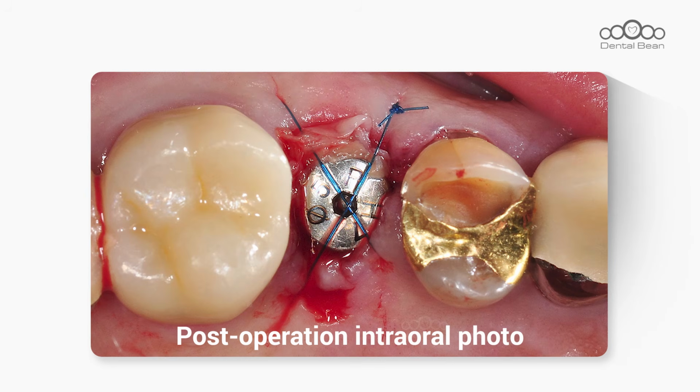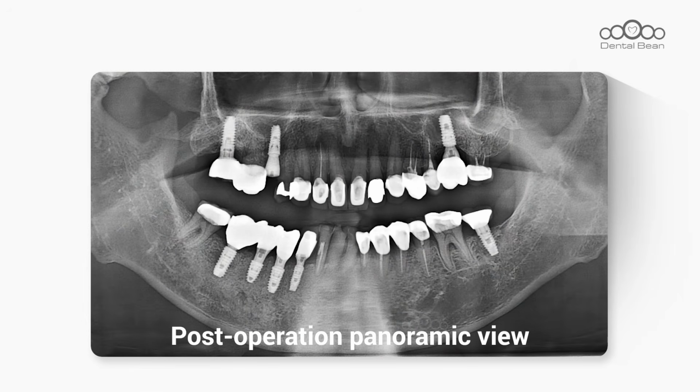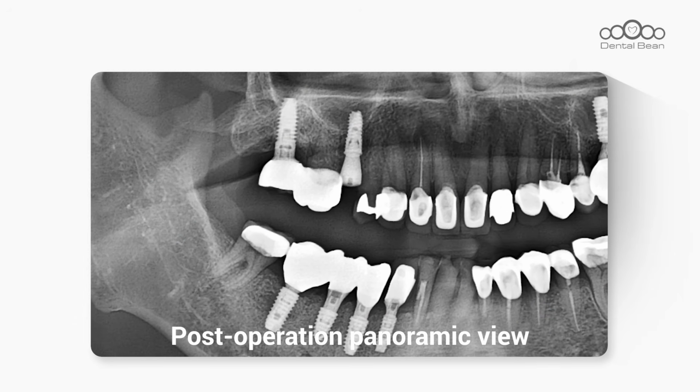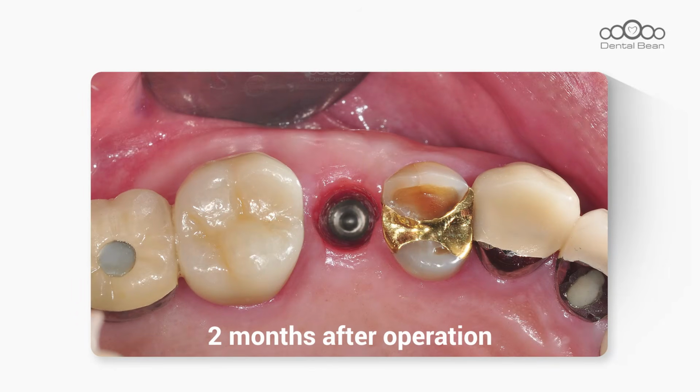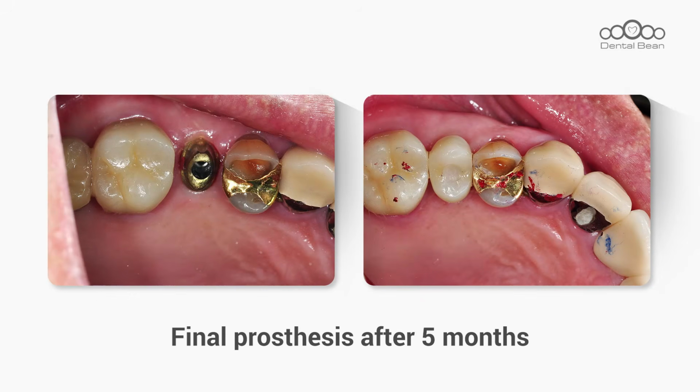Healing progressed uneventfully, and a custom abutment with a zirconia crown was successfully delivered as the final prosthesis.